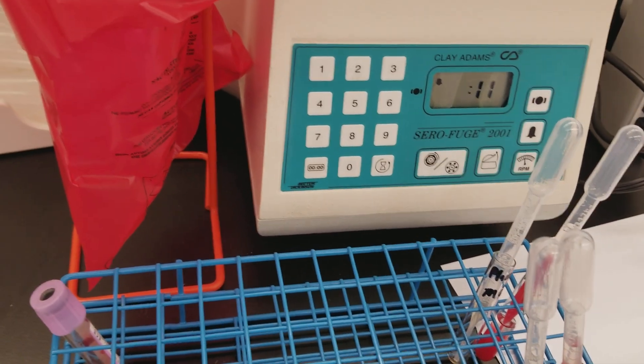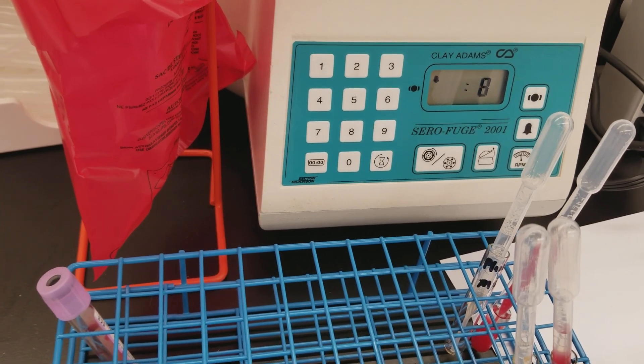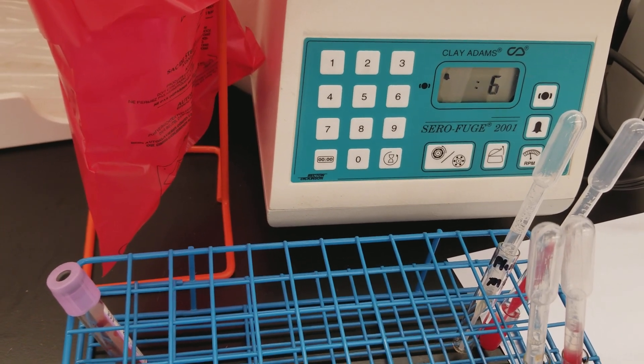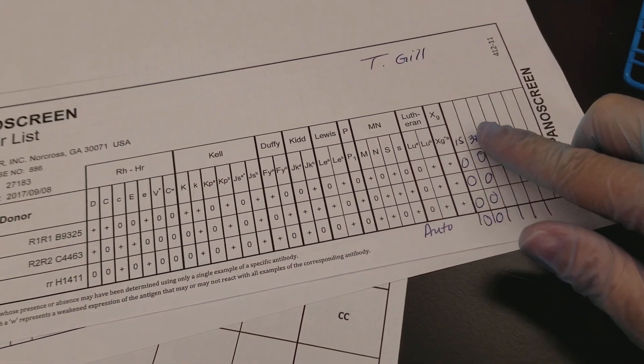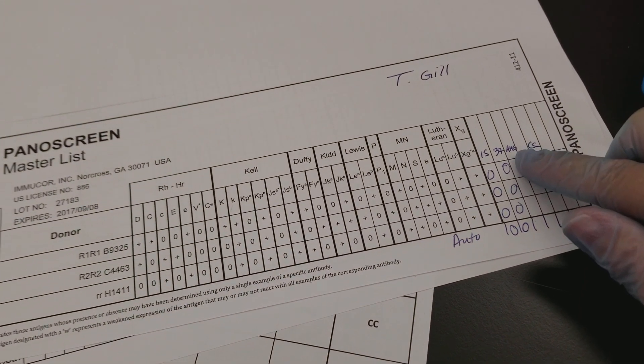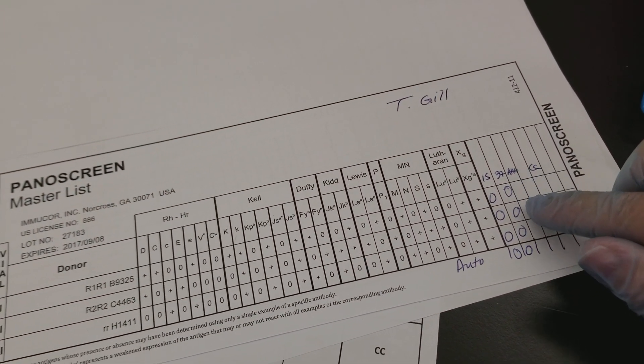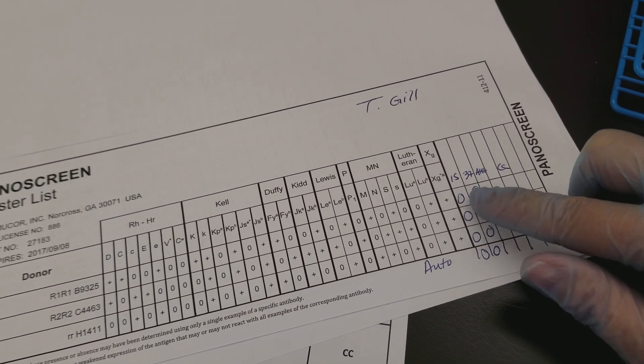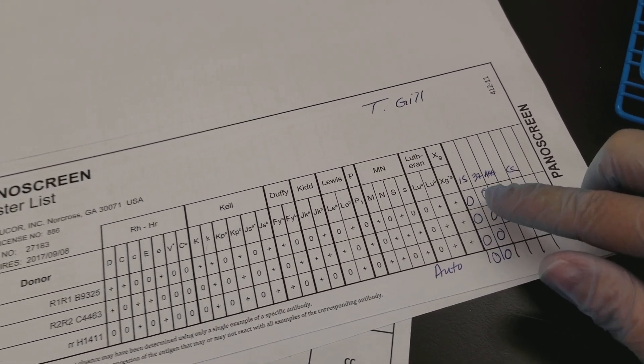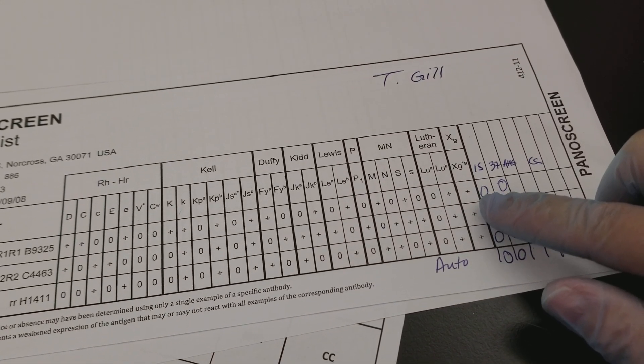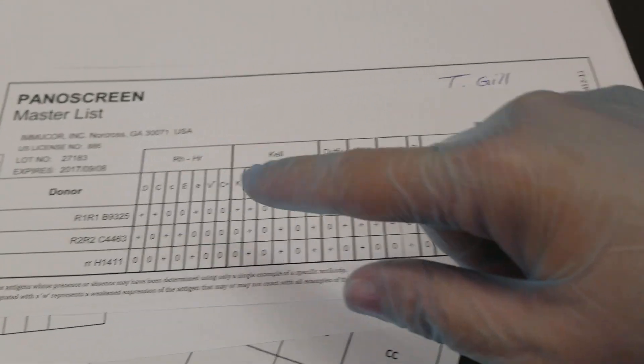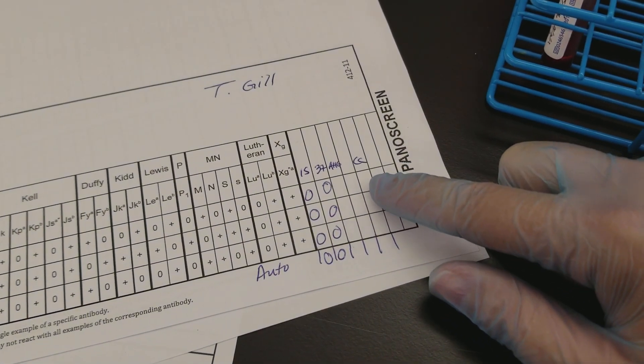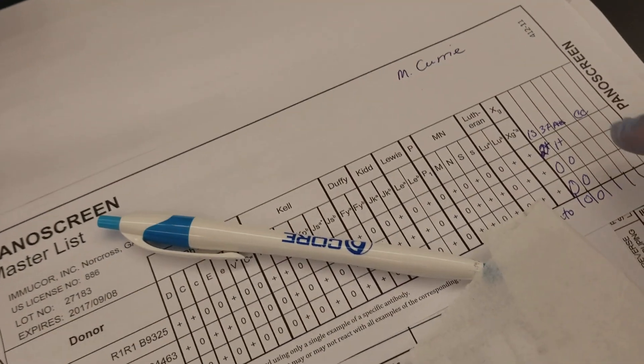So we added one drop of AHG reagent - I use the poly-specific. We are going to spin them and then we're going to look for agglutination, and that would be the final phase of this. And if all of the reactions in all the phases of a particular donor cell were negative, then we would add the check cells. If not, like cell one of this patient, we would not add the check cells.